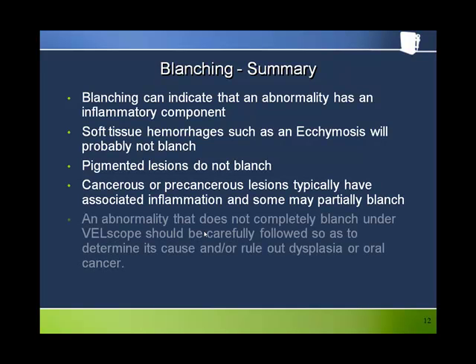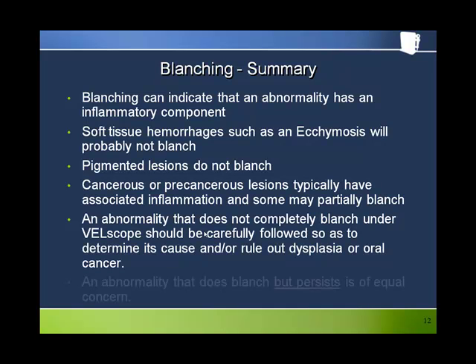However, the bottom line is that not only should an abnormality that does not completely blanch under VELscope be carefully followed, so as to determine its cause and/or rule out dysplasia or oral cancer, but also an abnormality that does completely blanch but persists is of equal concern. And this is a very, very important point.